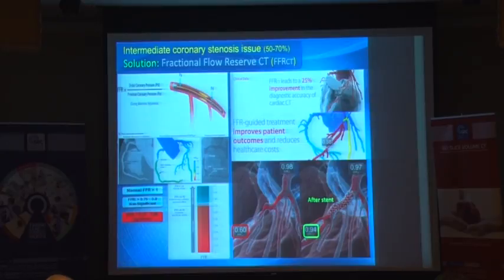Let's take a very rapid example. This is a patient having a problem. His FFR-CT before the site of occlusion was normal, and after the site of occlusion was 0.6. So there is a significant occlusion. There is a hemodynamic effect. So we are confirming that the borderline lesion here is having a hemodynamic effect. So this is very, very informative for us and for the cardiologist, of course. And this is the situation after stenting. You can see that the pressure got high again, above 0.7.